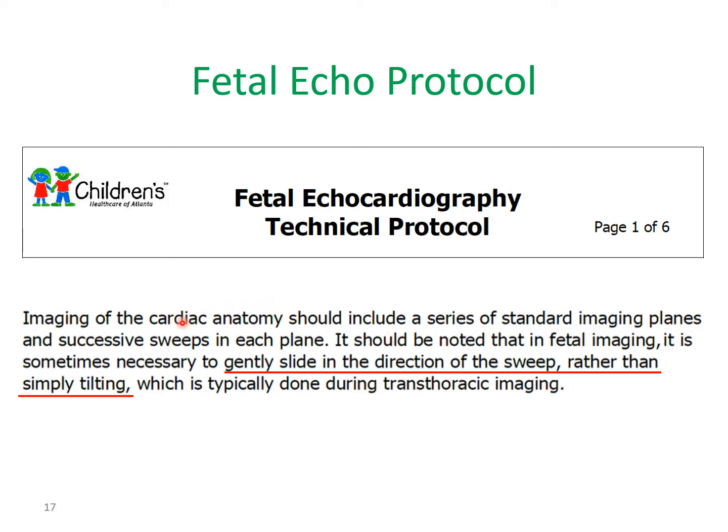Now, it's important also to know that when you're imaging the cardiac anatomy in the fetus, you should try to gently slide in the direction of a sweep when you're doing these sweeps through the structures, rather than just sticking the probe in one spot and tilting as you would during a transthoracic echo.